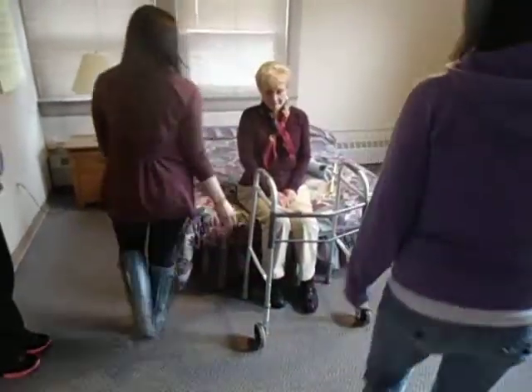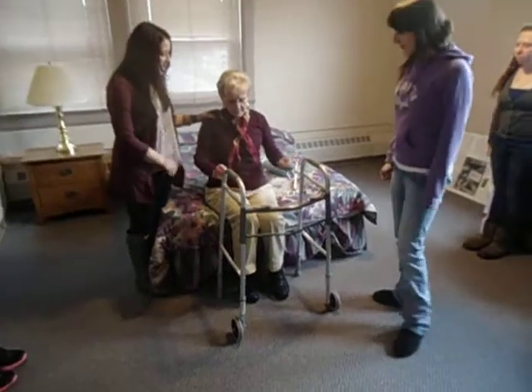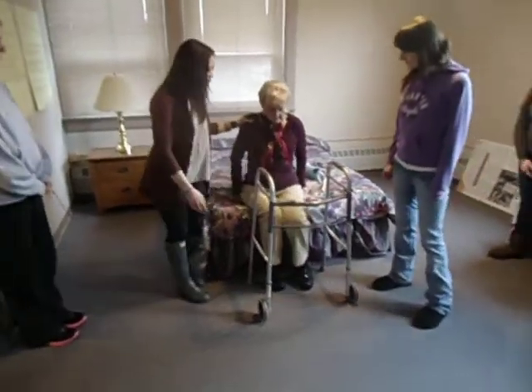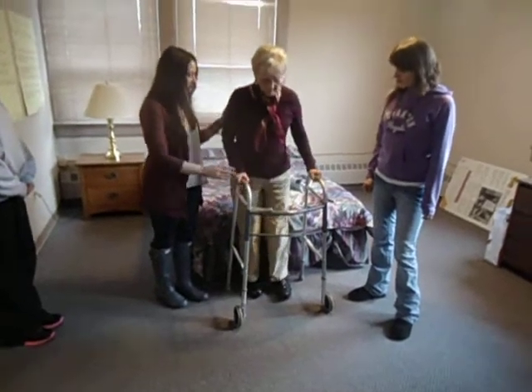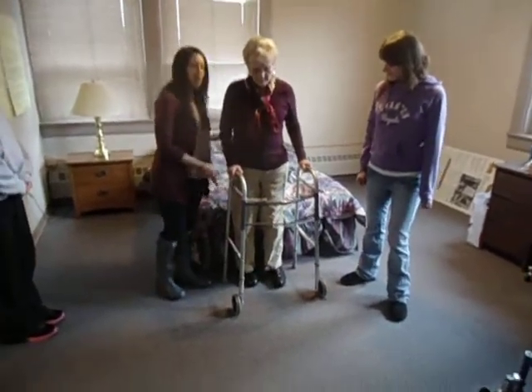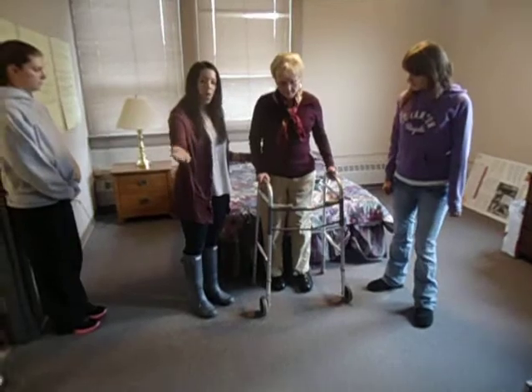Mrs. Jones, I'm going to take you to the kitchen. So can you stand up the way that Georgianne showed you without bending forward? Stand up. And now grab onto the walker. And I'm going to stand on your affected side, the side where you had your hip replacement. And we're going to walk towards the kitchen.